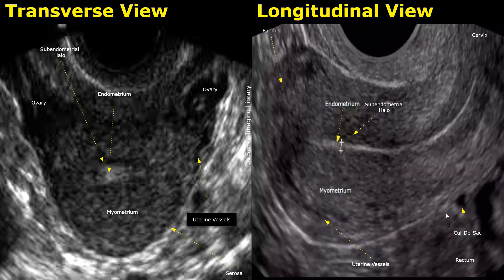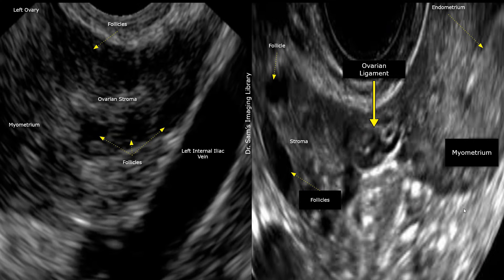In the supine position during an ultrasound exam, any free pelvic fluid tends to collect here first, due to gravity. In this view, the ovary is seen next to an anechoic tubular vessel — this vessel will be the internal iliac vein, which is usually seen next to the ovary. In this image, the area between the ovary and the uterus represents the ovarian ligament, which may be seen in some images such as this one.